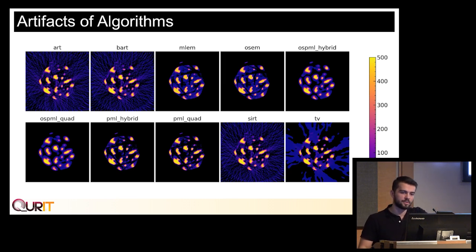Whereas with the other algorithms, I said that total variation performed the best, and by the way, it performed the best inside the tumor. But when you consider stuff outside the tumor, maybe it's not the best, because it's actually propagating stuff outwards here, and that could interfere with other predictions.